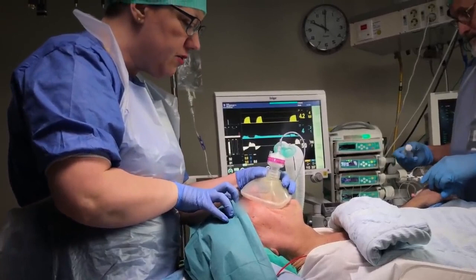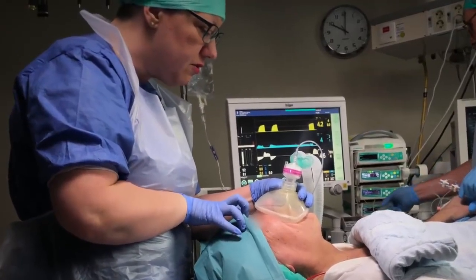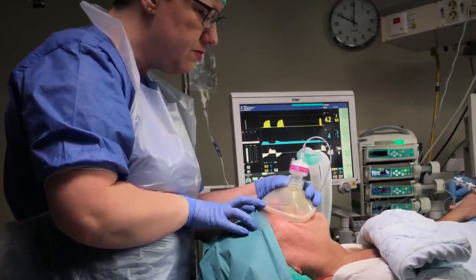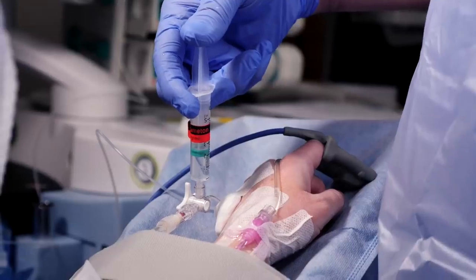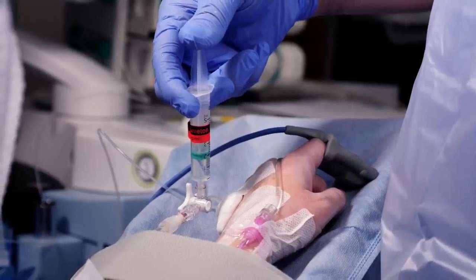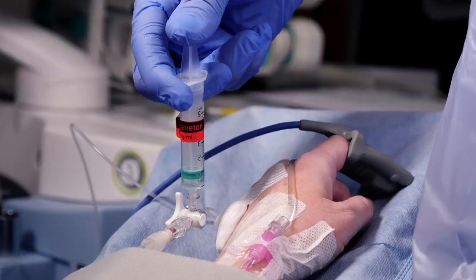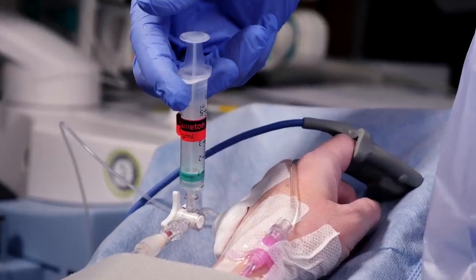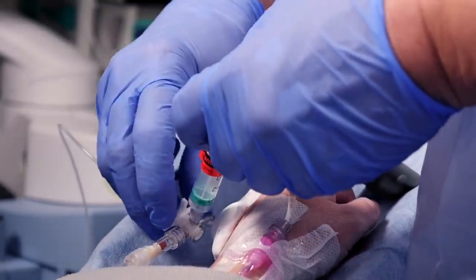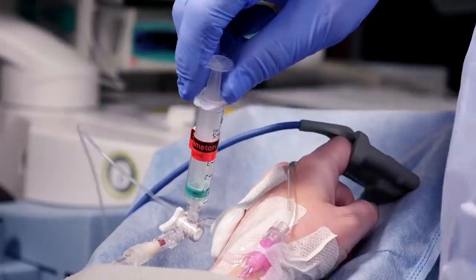A paralytic facilitates intubation. Traditionally, we would first have confirmed successful face mask ventilation, but no evidence has shown that this prevents airway complications. Therefore, the emerging consensus is to administer it as soon as the patient is unconscious.